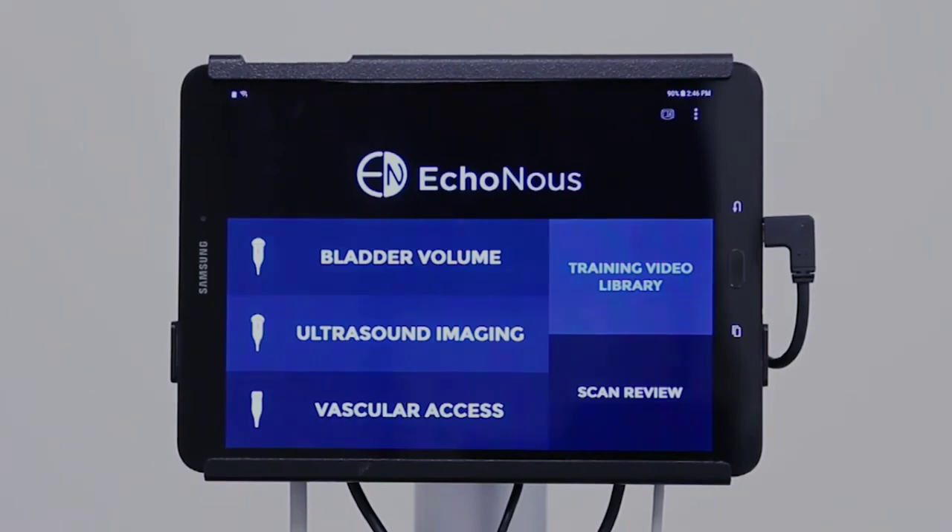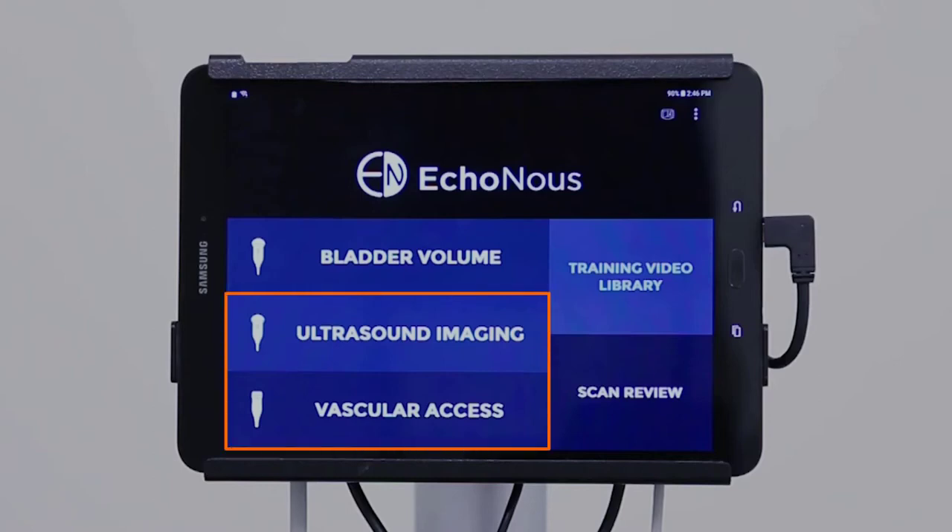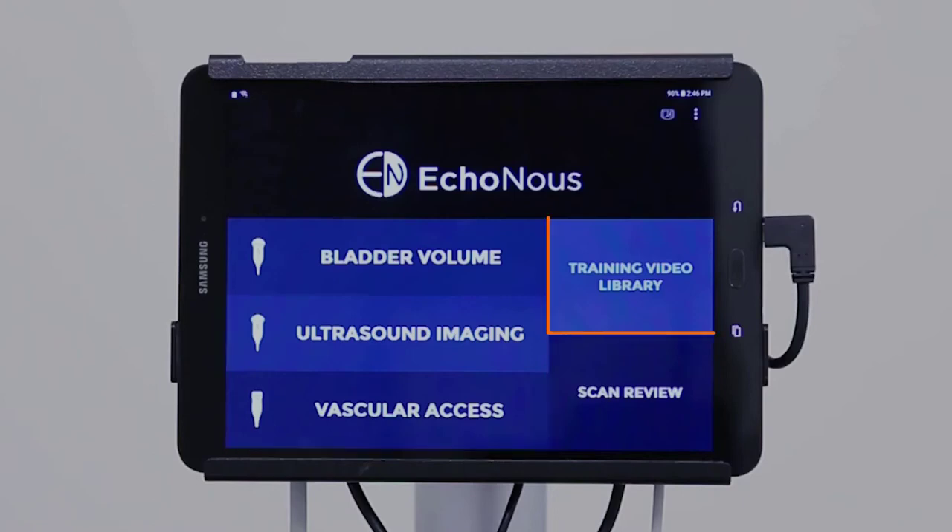Press the power button to turn on the device and to display the EchoNous home screen. The home screen may or may not display the ultrasound imaging and vascular access options — this will be based on the settings set by your individual institution. The training video library houses multiple videos that provide a quick review of device operations. This is a great resource to use when you need a quick refresher or if you need to teach a new user. Scan review is where saved exams will be stored.